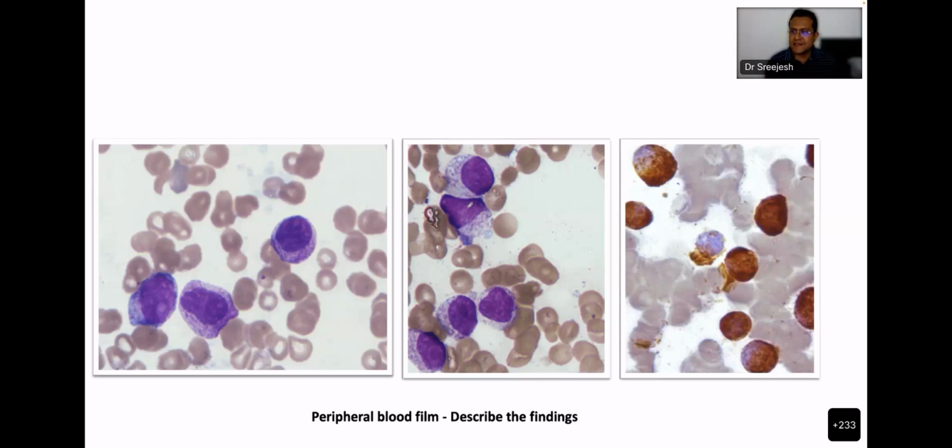If you see these kinds of cells in a marrow, what do they resemble? Are they resembling the classical promyelocytes, in which nucleoli are visible? They look classical. So we come to the thicker slide. And this one looks more like a myelocyte. Which one does it resemble, myelocytes or promyelocytes? Fine, this looks like a myelocyte. What about these cells? Do they look like promyelocytes or myelocytes? They look like myelocytes. Okay.